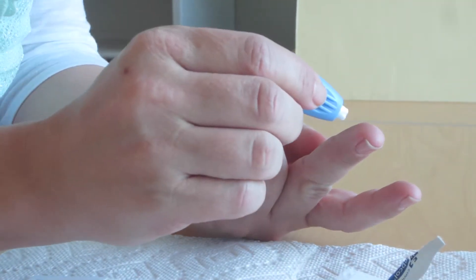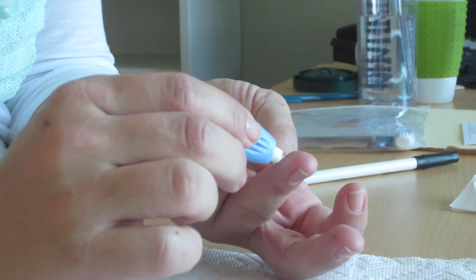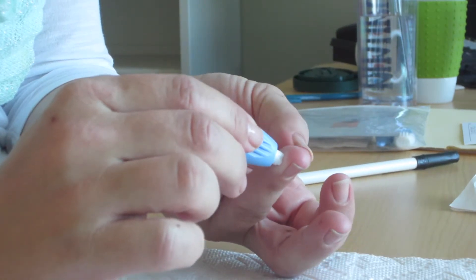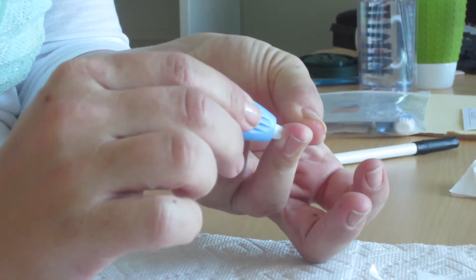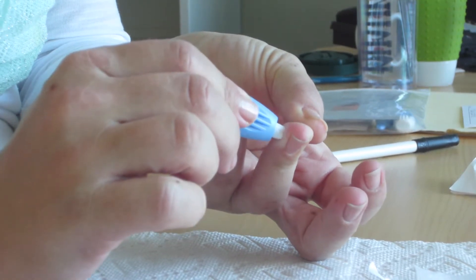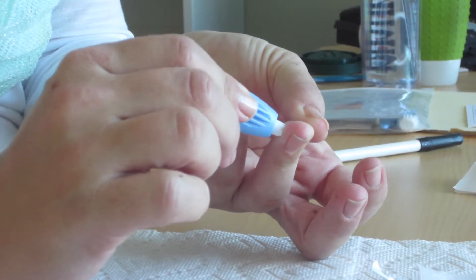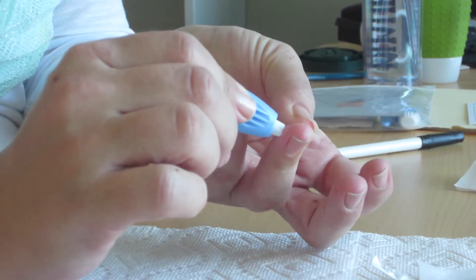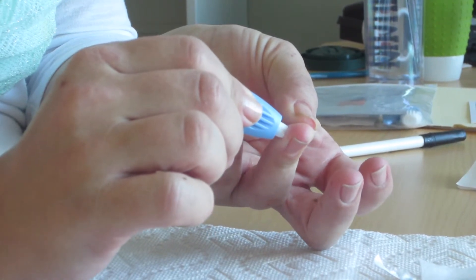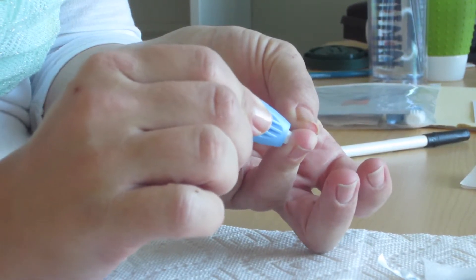Place the lancet on the fleshy inner side of the chosen finger. Bring the thumb of the chosen hand up to the tip of the chosen finger. Use the thumb to make the prick surface stretch tightly. Hold the lancet firmly against the tight portion of the finger and press down until you hear a click.